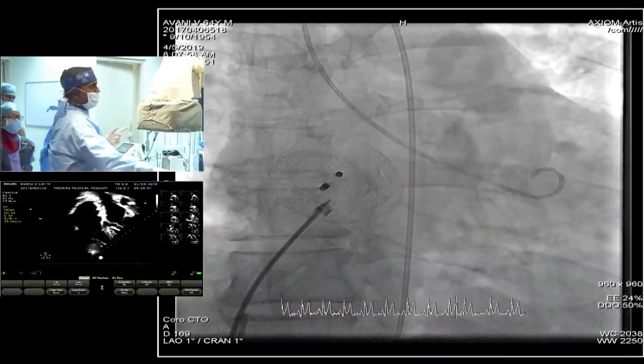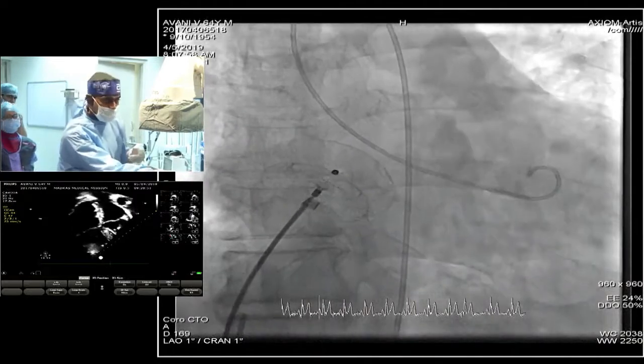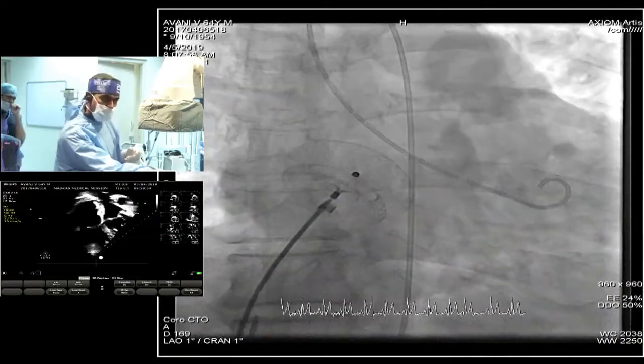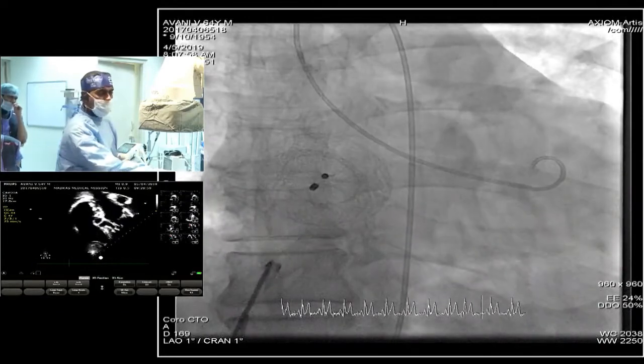It will be interesting if you have not looked at the paper. This was published I think about a couple of years ago in Catheterization and Cardiovascular Interventions, maybe 2000? Sorry, it's in the Annals of Pediatric Cardiology. Was it in 2000?